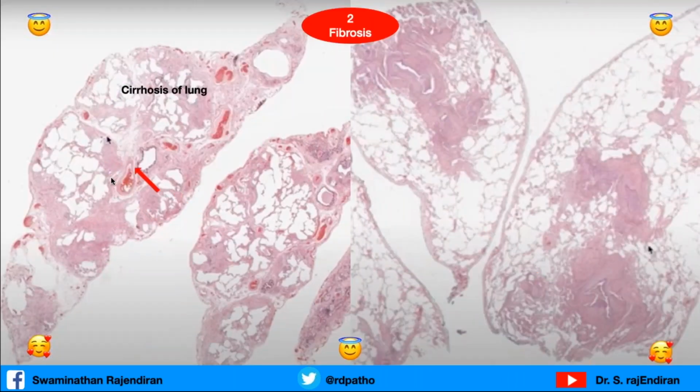So I want to use that terminology, cirrhosis of lung. Normally, when you take a biopsy of the lung, it will be smooth surfaced, okay, with functional lobules. Whereas here, it is a very rough surface and it is more fibrosis, looking like cirrhosis of liver. So this pattern 2 is characterized by cirrhosis of lung.